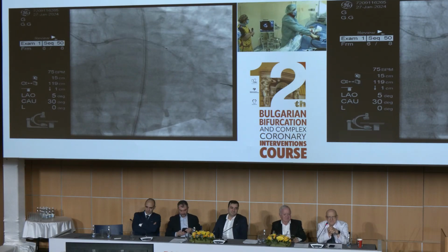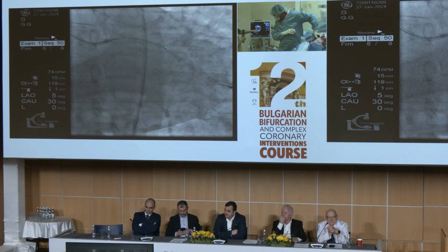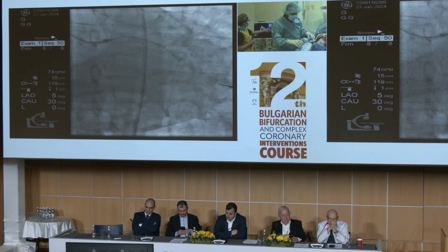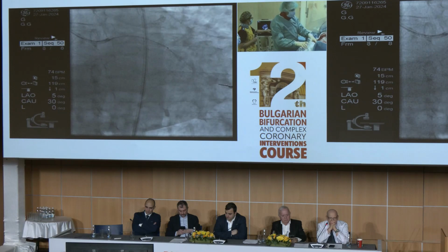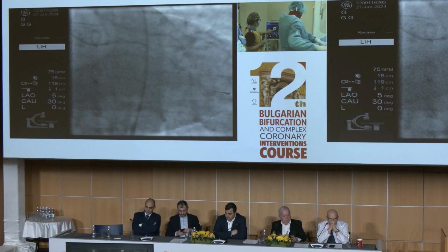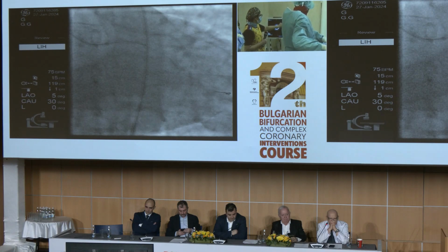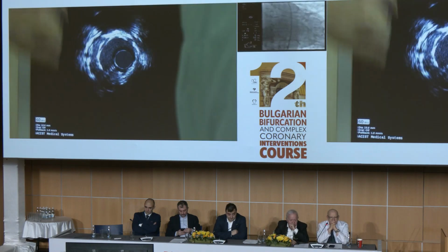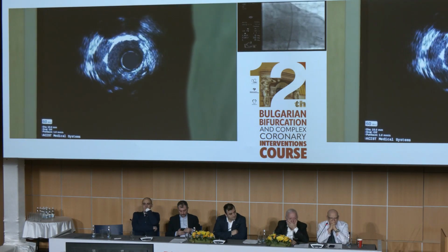Yes, okay, so we made an IVUS, and as usual, can I see, just give me live, I want to see. The ostium of the stent should be a little bit closed here.